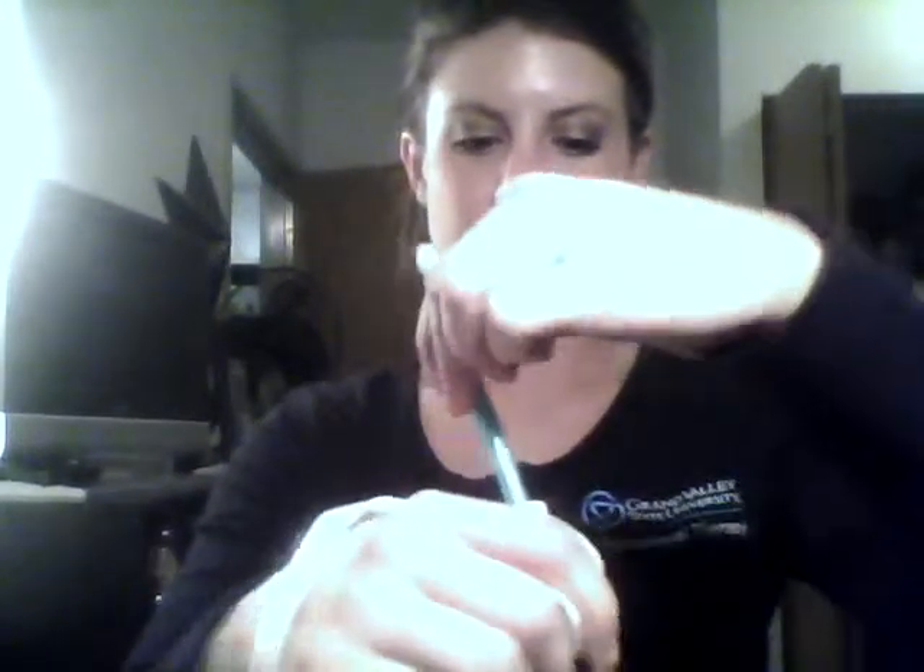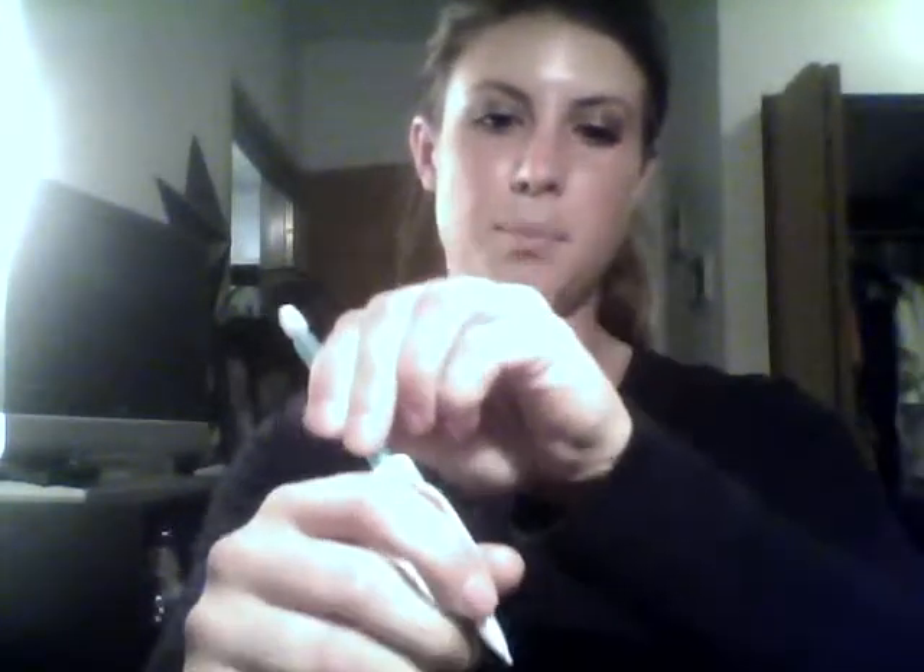To put this on, the client would slide their thumb through the thumb support and rest the index finger on the support there. There is a little strap that goes around to the palm of the hand, over the top for added support. Then you take your writing utensil of choice and slide it through the loop so it rests comfortably between the finger and the thumb.